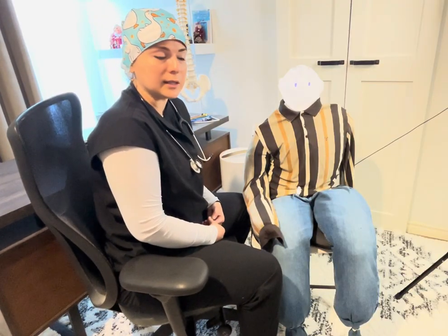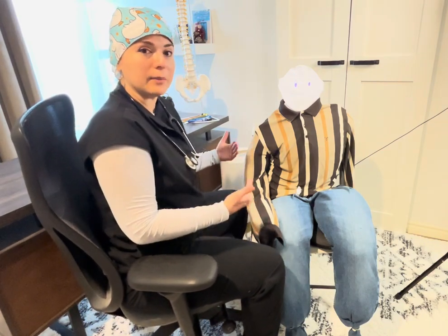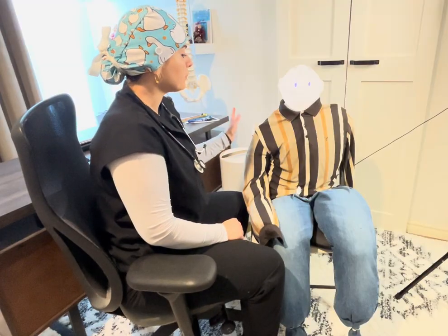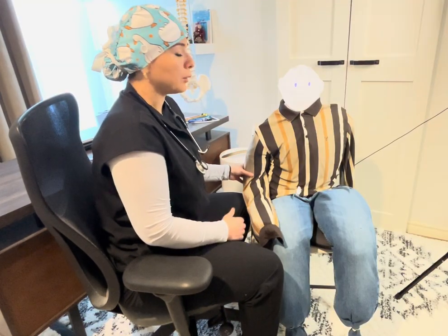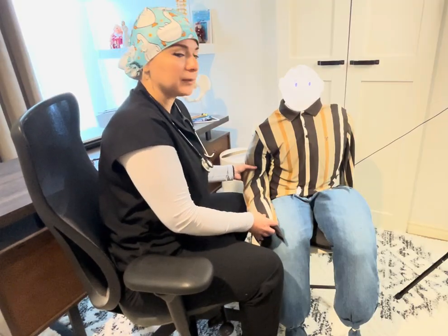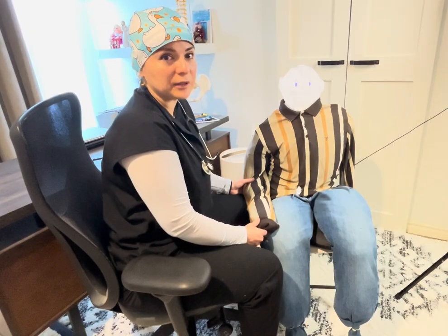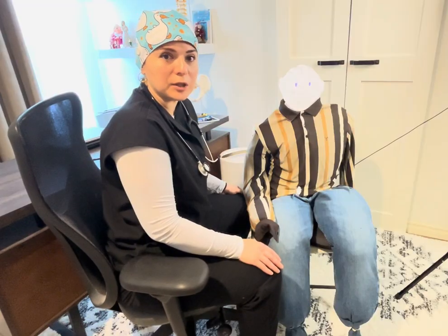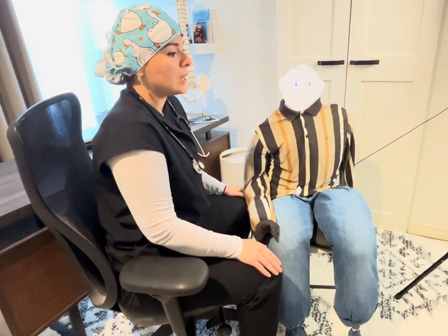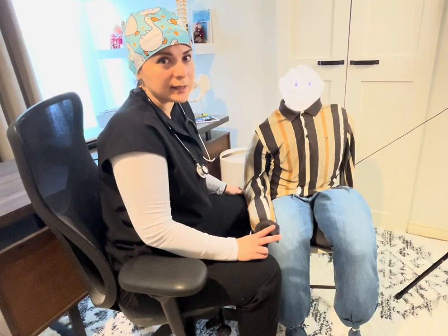Position yourself comfortably as well — I am sitting on the patient's right side. Make sure to help your patient support the arm you are performing this skill on. This arm should be at the level of the heart; if it's lower or in a different position, the blood pressure reading is not going to be accurate.